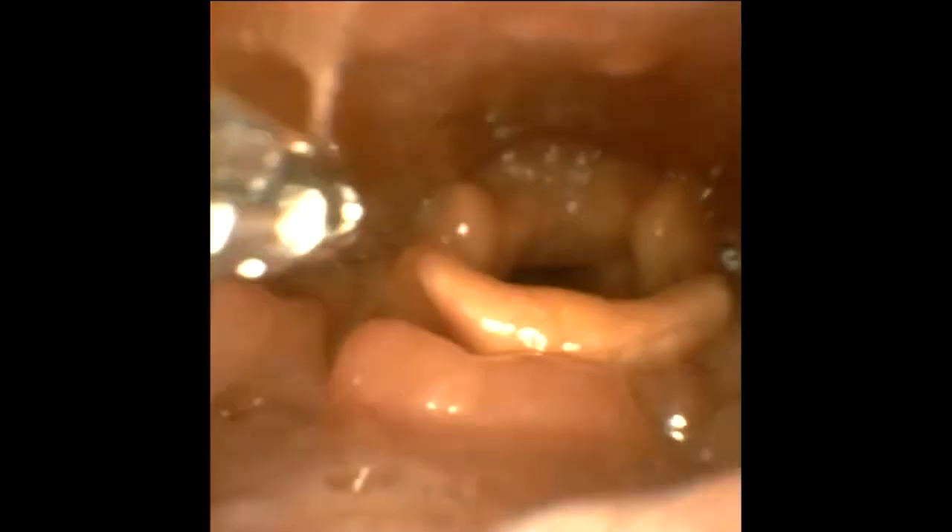So as we watch this, my colleague Mr. Jamma is inserting a flexible forceps through the nose endoscope, which will help us to grab the fish bone and remove it. Now I've got control of the flexible nose endoscope and I'm maneuvering that into position, so my colleague can grasp the fish bone with the forceps and we're gently maneuvering the fish bone out of the tongue.